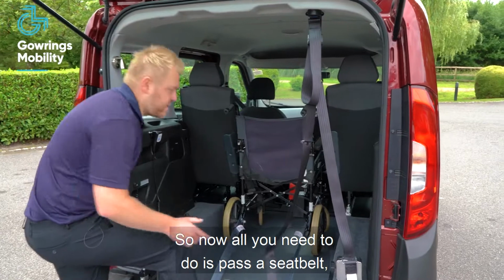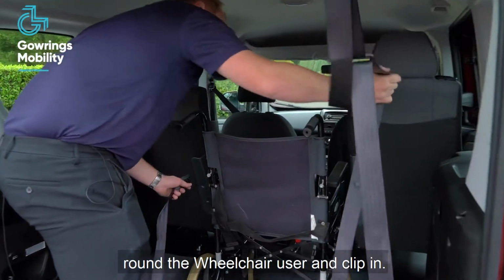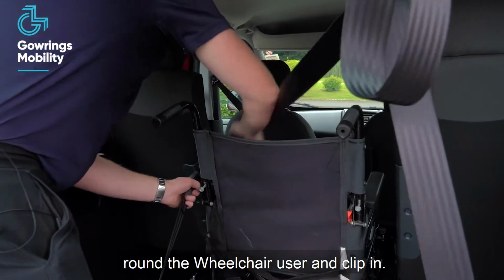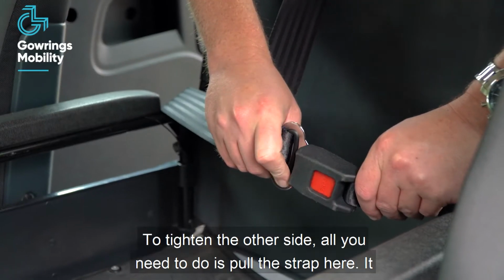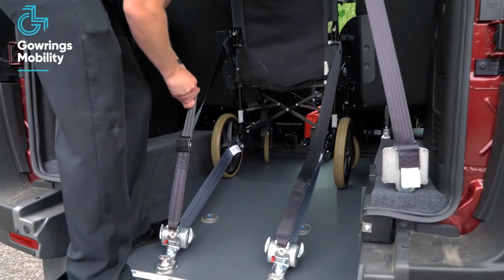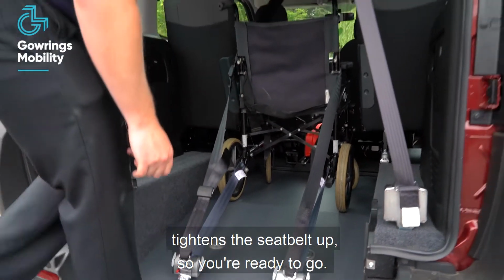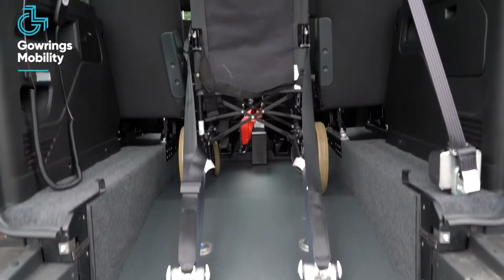So now all you need to do is pass the seatbelt round and clip in the other side, and to tighten, all you need to do is pull this strap here and tighten the seatbelt up so you're ready to go.